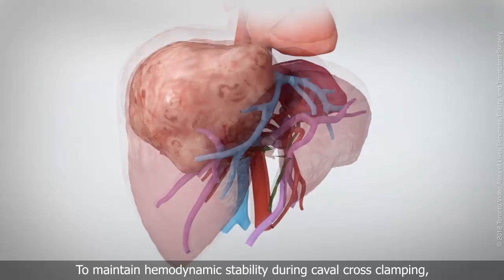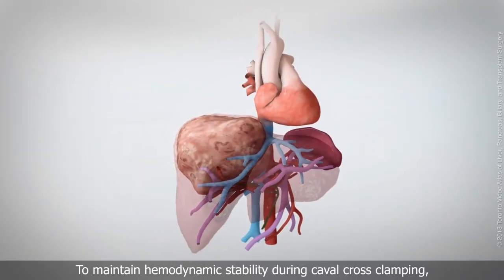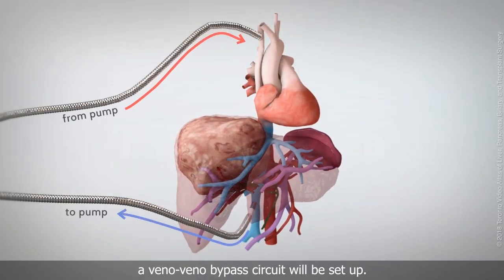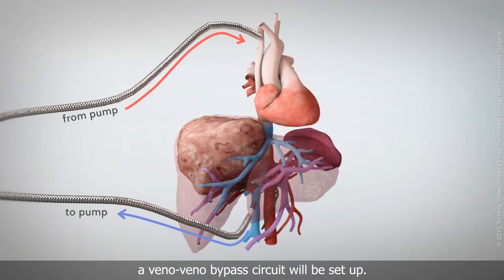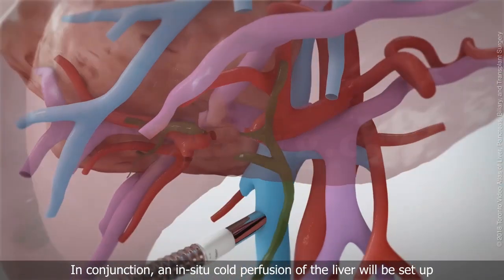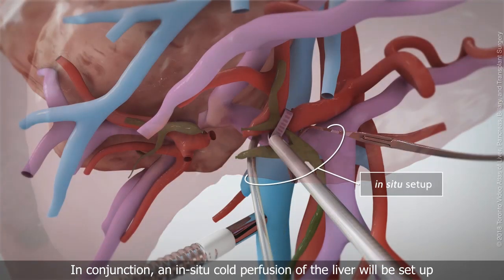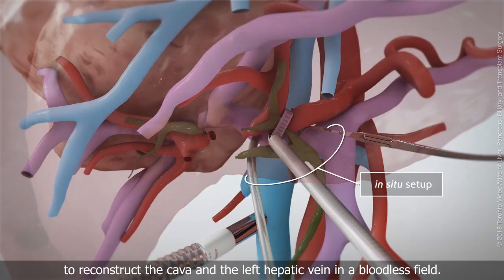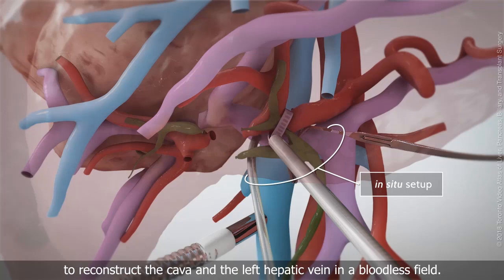To maintain hemodynamic stability during caval cross-clamping, a veno-veno bypass circuit will be set up. In conjunction, an in-situ cold perfusion of the liver will be set up to reconstruct the cava and the left hepatic vein in a bloodless field.